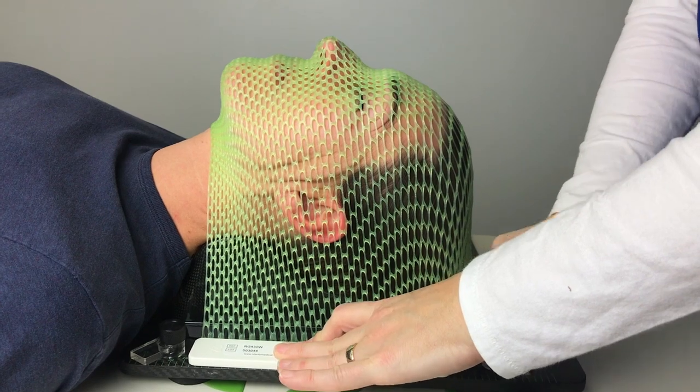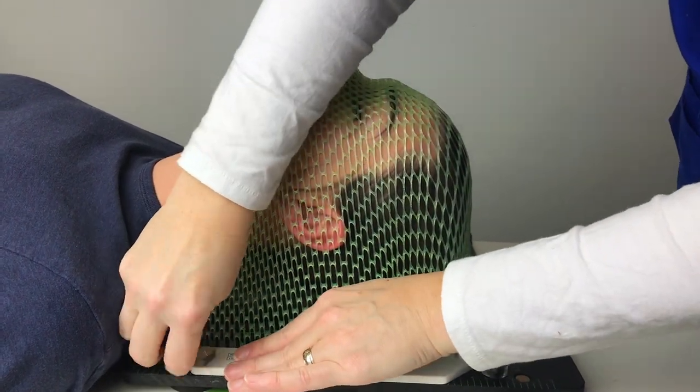Once the frame is down to the base plate, use the turn clips to secure all four points to the mask.